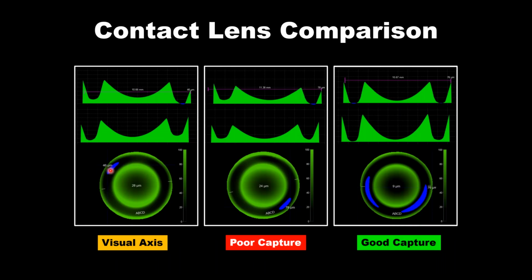Notice one acute side where the lens will land down. Again, one acute side where the lens will land down. But with the same eye and a geometric capture, now we're seeing the arcuate areas of landing that we really would expect in a symmetric cornea.